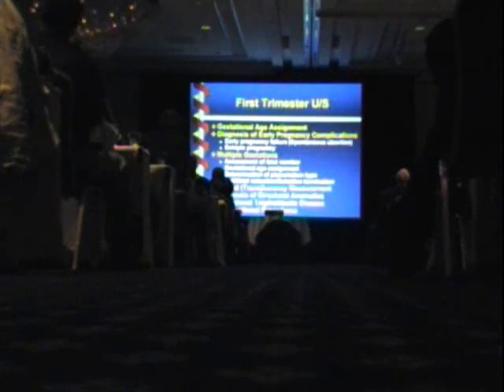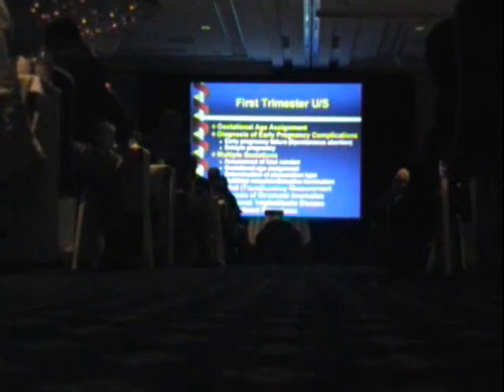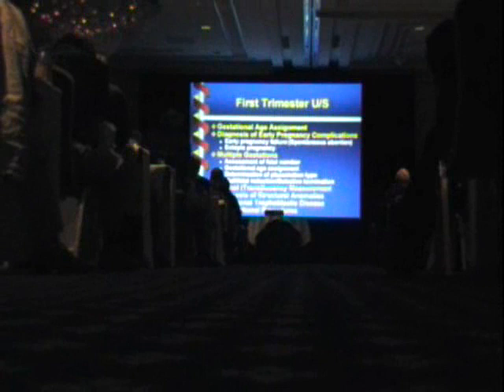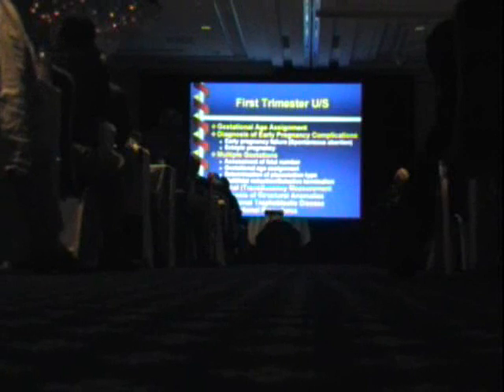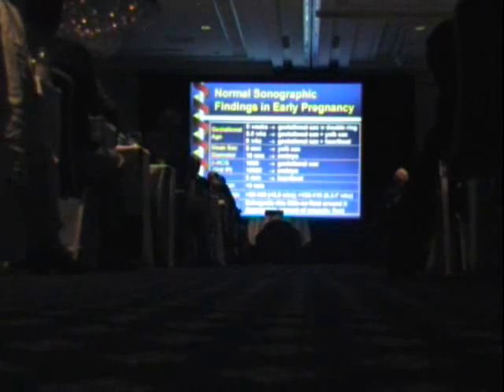Okay. So let me move on to the body of the talk, and then I'll come to that at the end. There are all sorts of things we can do today with ultrasound in the first trimester, from assigning gestational age, which you just heard me talk about, and I won't say anything more about, diagnosing some early pregnancy complications, including early pregnancy failure, also sometimes termed spontaneous abortion, diagnosing ectopic pregnancies, diagnosing and characterizing multiple gestations, the nuchal translucency measurement, and others. Now, obviously, in 30 minutes, I'm not going to have time to go through all of these, but I'll try and touch on some of the highlights.